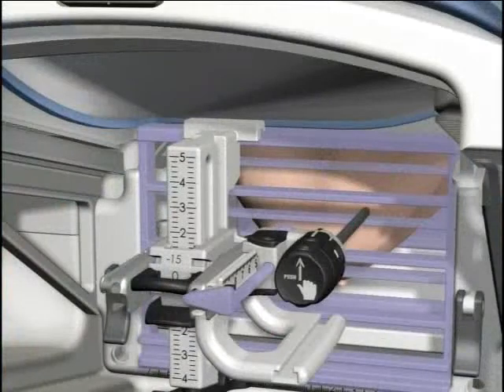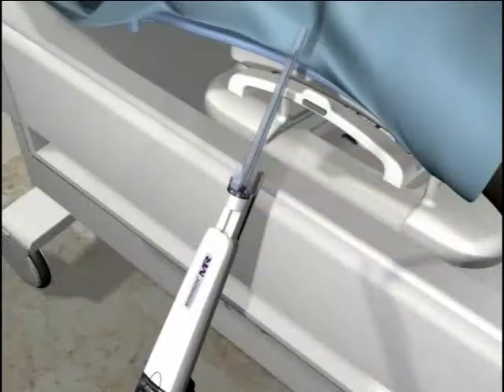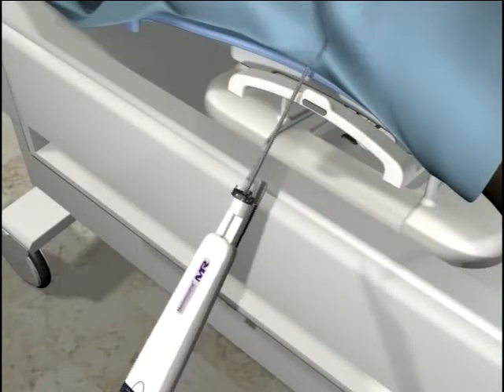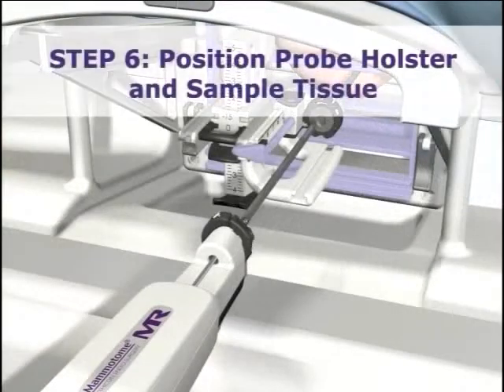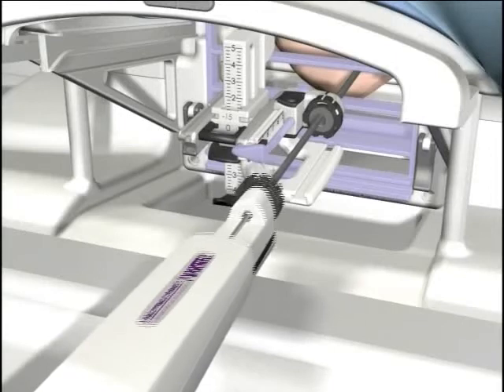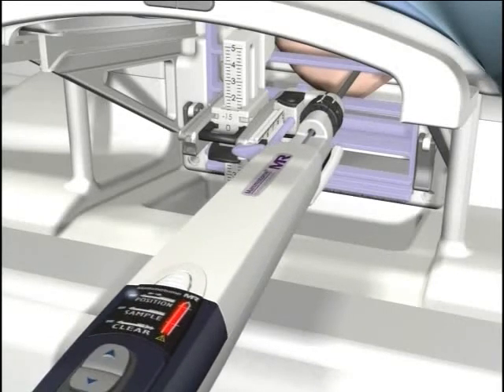You are now ready to insert the Mammatome device. Remove the obturator stylet and cap from the sleeve assembly. Remove the tip protector from the biopsy needle and place on the sterile table. Make sure that the indicator on the probe thumb wheel is in the same orientation as the indicators on the targeting assembly thumb wheel. Slide the holster and probe into the sleeve and cradle until the probe thumb wheel is flush with the sleeve mount. You are now ready to take samples.